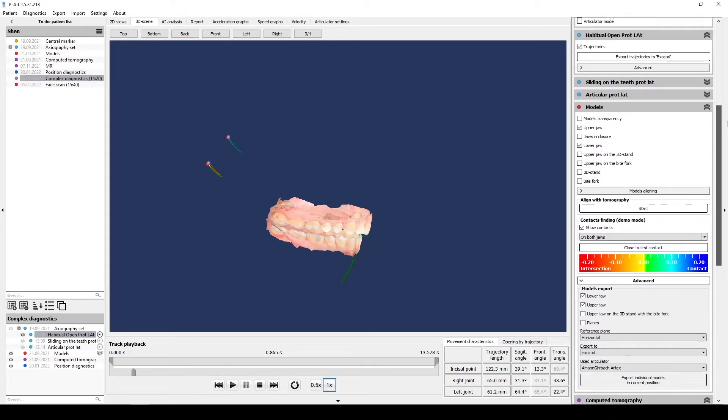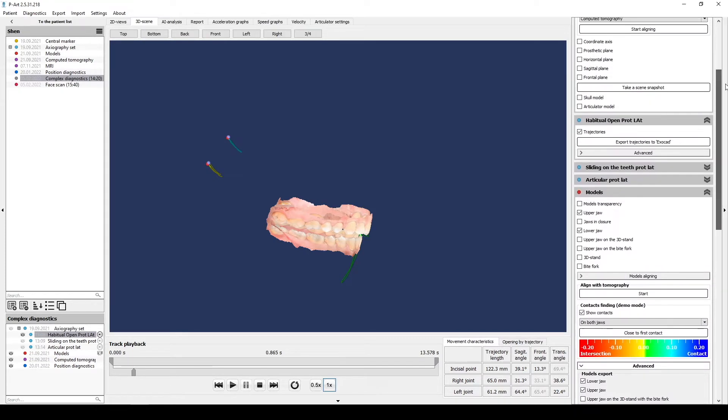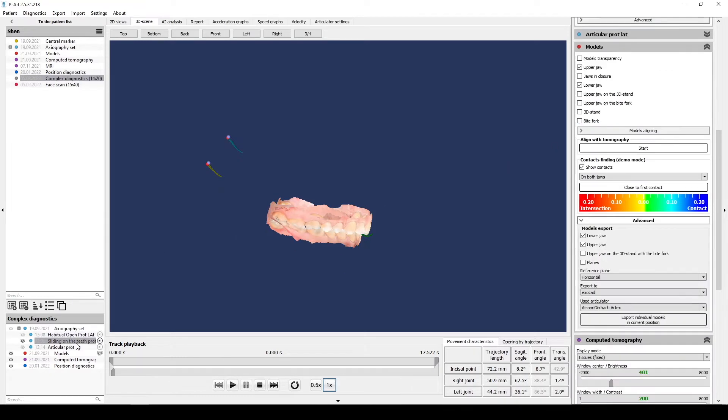The next step you can export Axiography trajectories. For that you need to find section with Axiography in the right menu. They are marked with a blue circle.